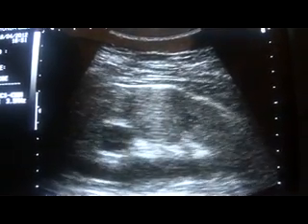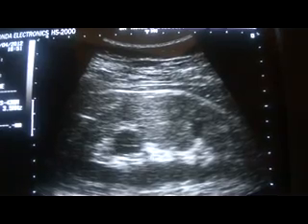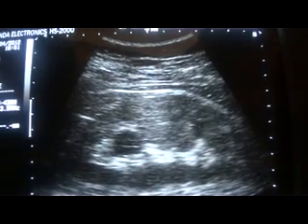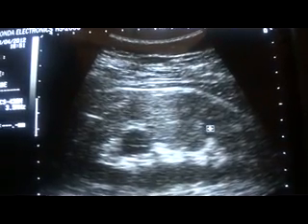Here you are again — this is the same cyst in transverse section. This is the cystic area; this is the kidney's outline capsule. So the kidney is otherwise normal. Here we are seeing the cystic area at the upper pole of the left kidney, which is a simple medullary cyst.